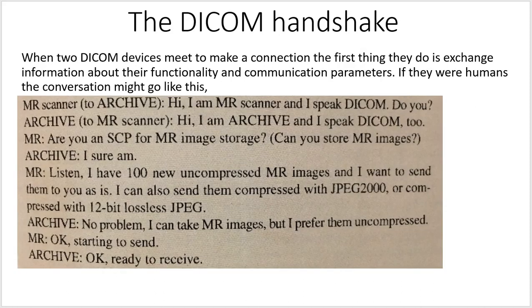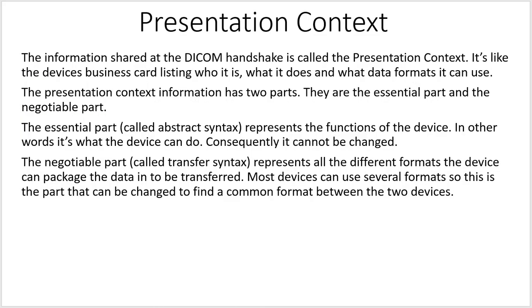So if we look back at our conversation, this first part here, I am an MR scanner and I speak DICOM, I'm an archive, that is the abstract syntax. And that part can't be changed because the MR scanner is always the MR scanner and the archive is always the archive. So that's the essential part, or abstract syntax, that represents the functions of the device, and it can't be changed.